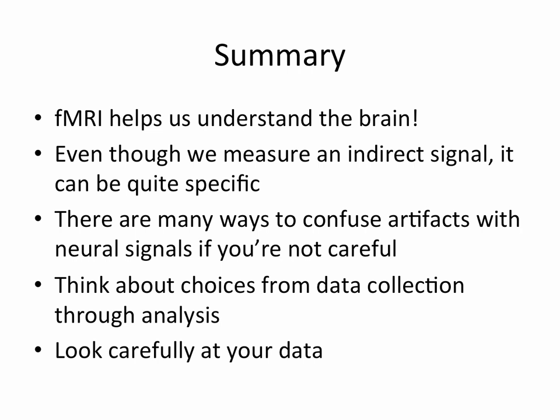And you want to think about your choices from the entire process: why you're collecting data in a certain way, why you're analyzing data in a certain way. And most important, just look carefully at your data. I think this has finally stopped, but for a long time, people were showing studies in the orbital frontal cortex, in a frontal inferior area of the brain, showing all these findings, and someone would ask, did you look at your signal dropout in the area? And the person would say, what do you mean? And then they'd put up the raw data, and there's no data there.